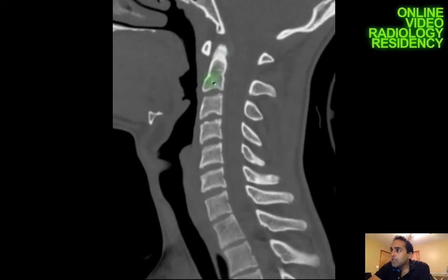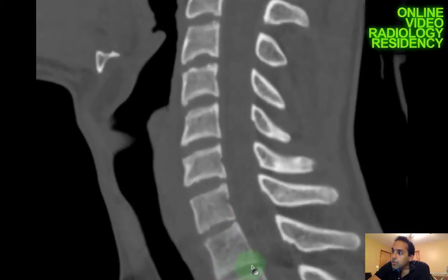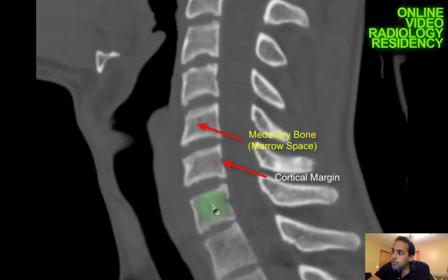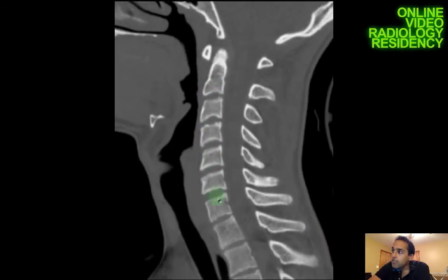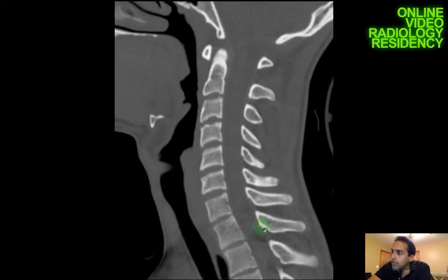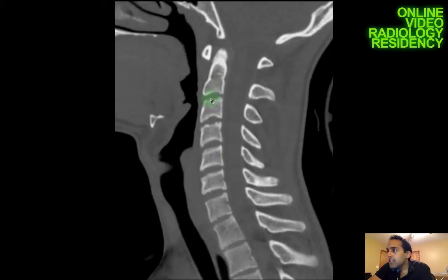I'm looking at the alignment — there should be a nice gentle lordosis to the cervical spine. I'm checking each vertebral body, looking at the cortex peripherally and the medullary space internally, making sure each cortex is intact and the vertebral body has a normal height with no fracture. I'm also looking posteriorly at the spinous processes for fractures — you can get a clay shoveler's fracture at C6 or C7. I'm also looking at the disc spaces between each vertebral body.